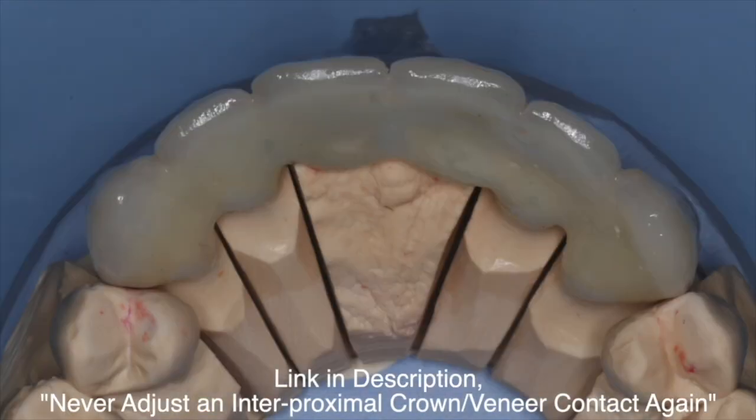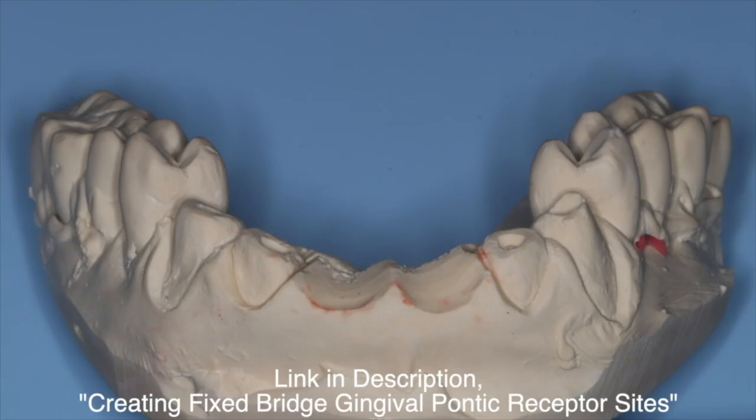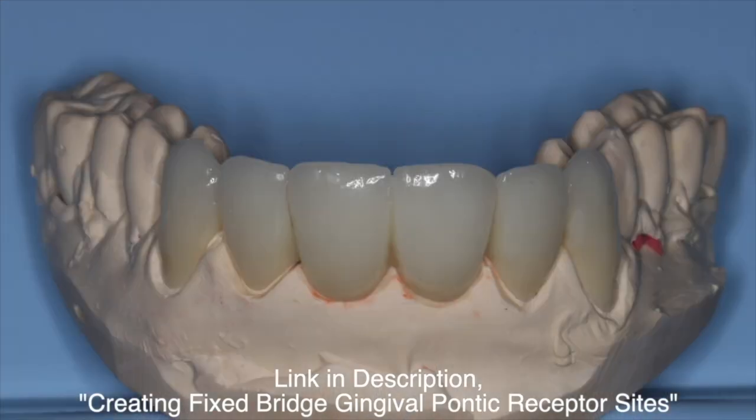Here's the final bridge. This is a zirconium framework with a lithium disilicate overlay.